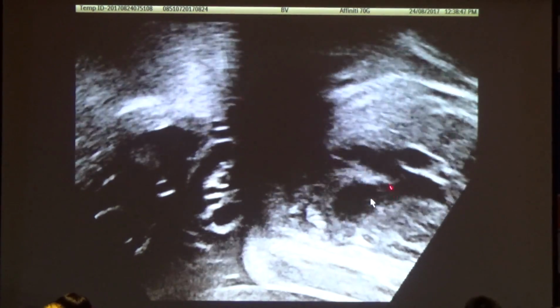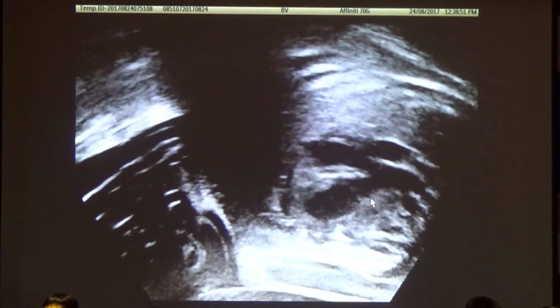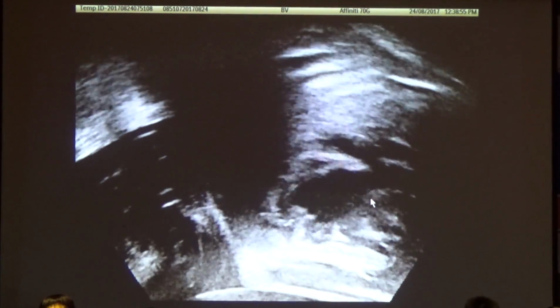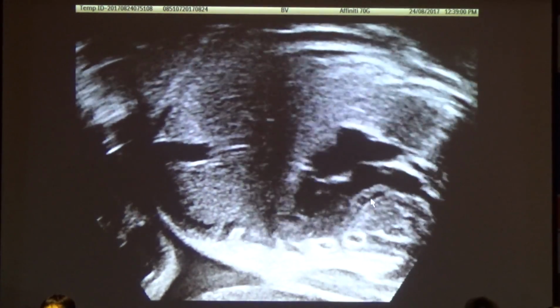But the one thing you need to know, there we go, the one thing that you need to know about fetal echo is if you don't have patience, then you should go and find some other way to make a living. Because you need patience in this game.